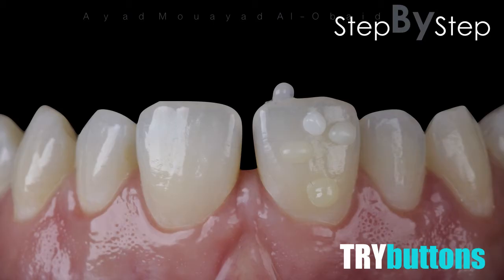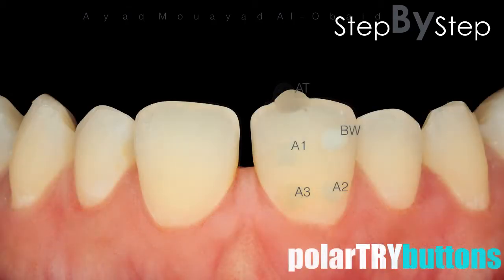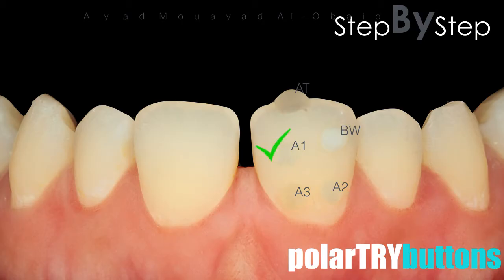We take the shades using the try-buttons technique. I prefer to use body shade only for diastema cases, with a polar image to take the shade, and confirm it using a black and white image.